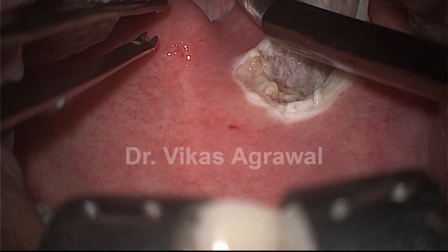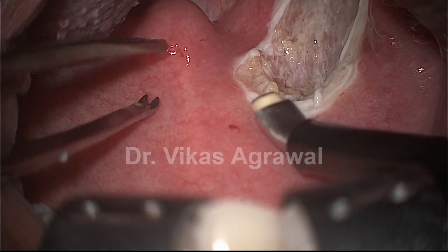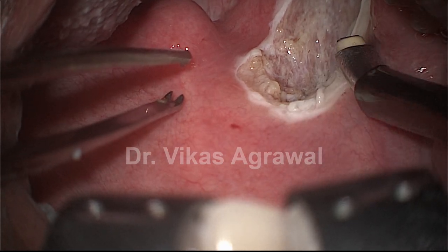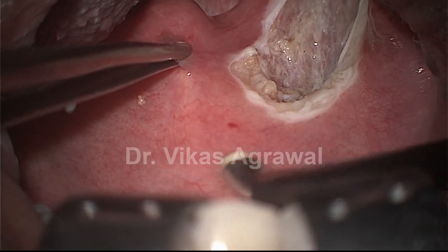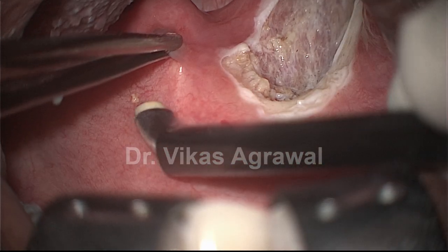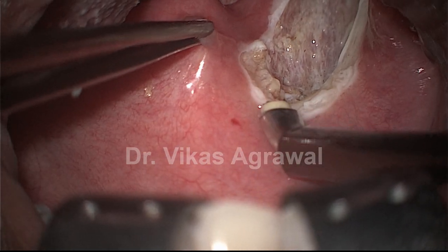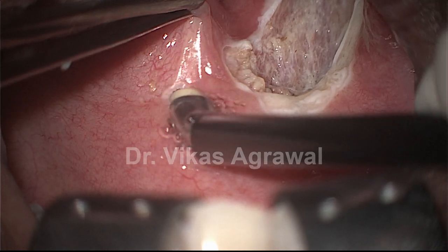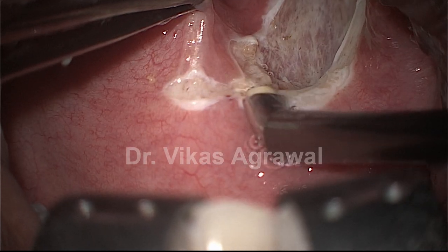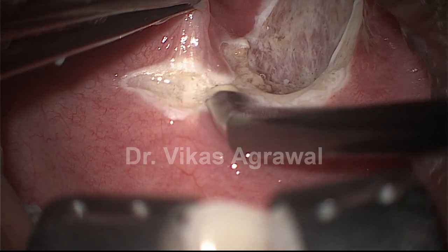We cannot take a particular length in measurement when we decide how much tissue is to be removed. If the anterior pillar is actually coming till here, we know that the levator palati muscle will be here, and as long as we make our limit at anterior pillar to anterior pillar we are still not going to damage it. I am resecting this long soft palate along the line joining anterior pillar to anterior pillar.